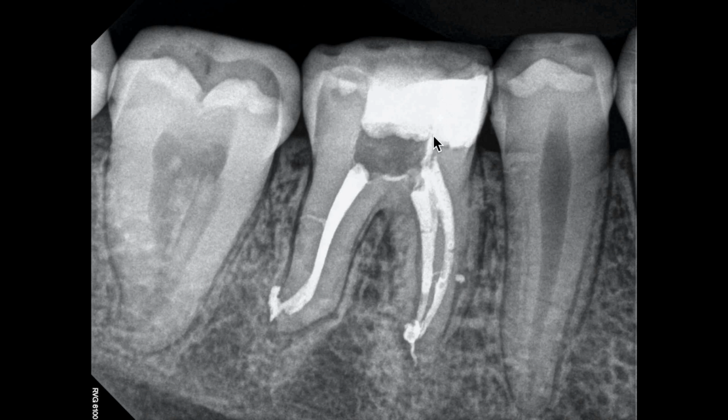You can see where I packed this wall underneath that filling. The filling's intact here. And then here's my access. And these little points were those wear facets. If you go back in the video, you'll see the wear facets that were there. That's it. Job is done.